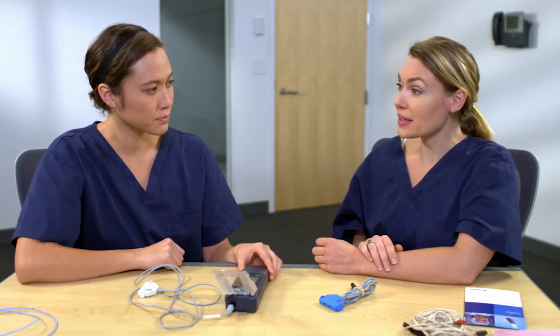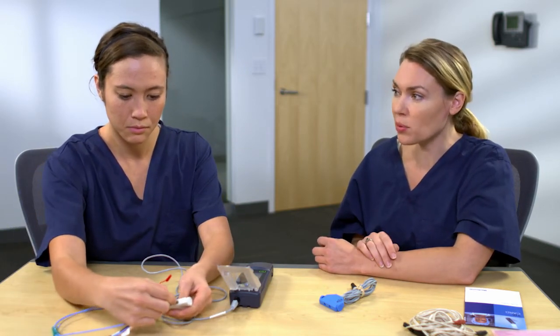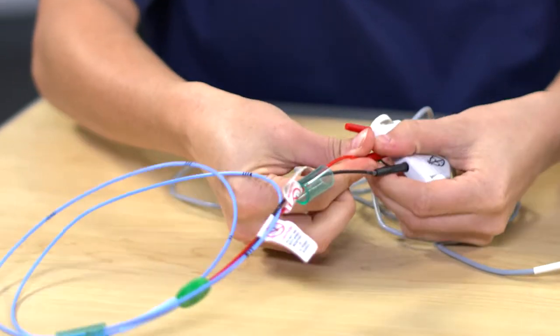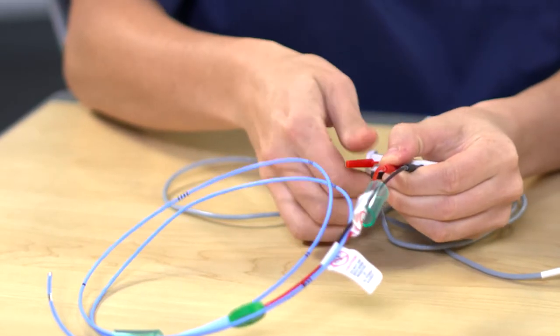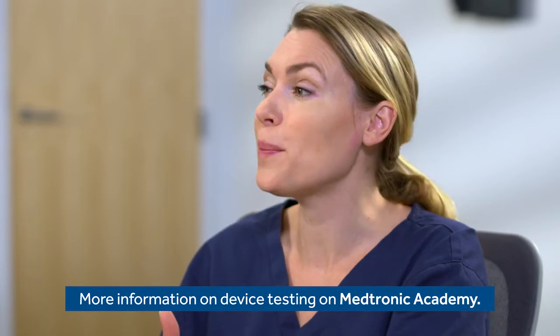Next, you'll connect the lead to the cable. For bipolar leads, match the polarity of the lead end to the cable receptacle. When first connecting the device, you would proceed with a sensing test followed by a pacing threshold test. Once the device is ready to use, you'll want to place it near the patient so that it can be observed by the medical staff. One option is to use the IV pole hanger.